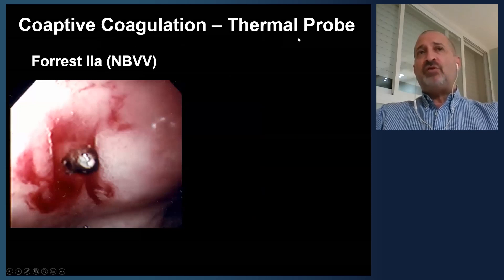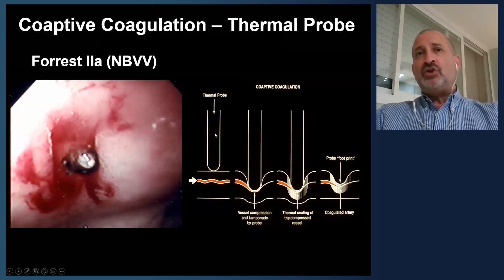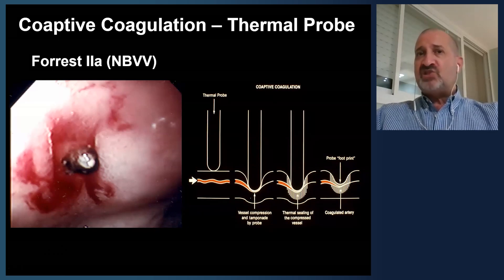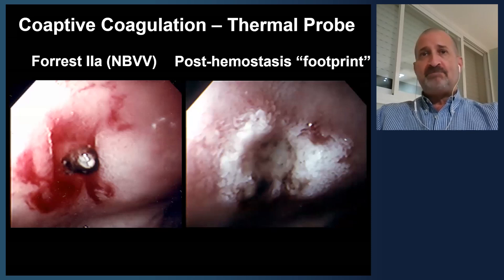This illustrates coaptive coagulation using a thermal probe for a Forrest 2a lesion — a non-bleeding visible vessel. You see this protuberance in the ulcer base. Push the probe down, hold for 8 to 10 seconds at low wattage, and seal the underlying vessel closed. The result is a post-hemostasis footprint — that's what you're aiming for. You want to completely eliminate that protuberance.